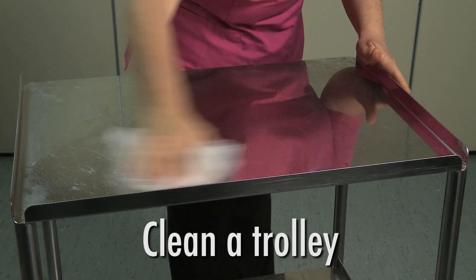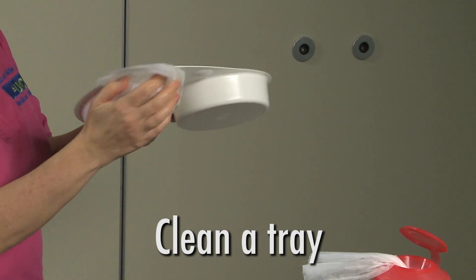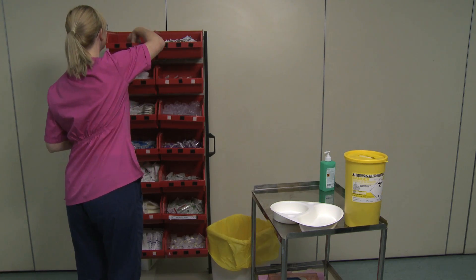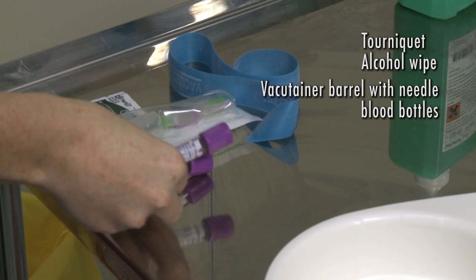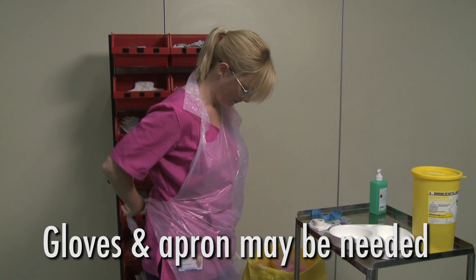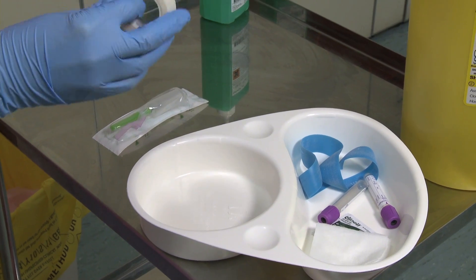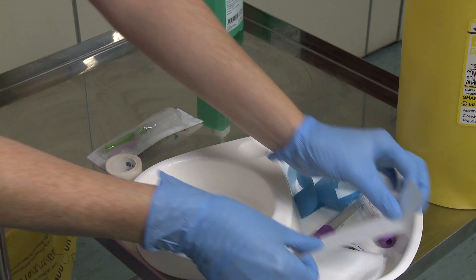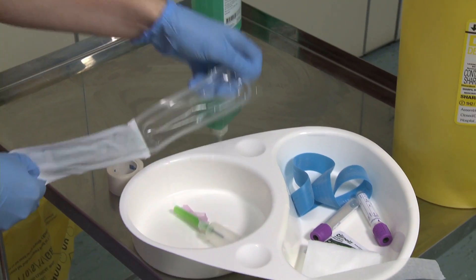Clean a dressing trolley with an alcohol wipe. Clean a tray with an alcohol wipe, first on the inside, then the outside. You will need a tourniquet, an alcohol wipe, a vacutainer barrel with needle, blood bottles, gauze and tape. Some trusts require that you wear gloves and an apron whilst assembling the equipment. In this video, we have used a tray with two chambers — one chamber for equipment out of the packet and the other for those that remain in their packaging.